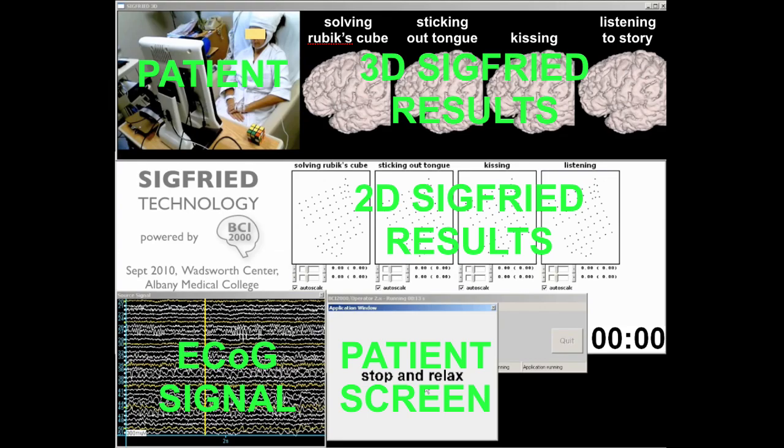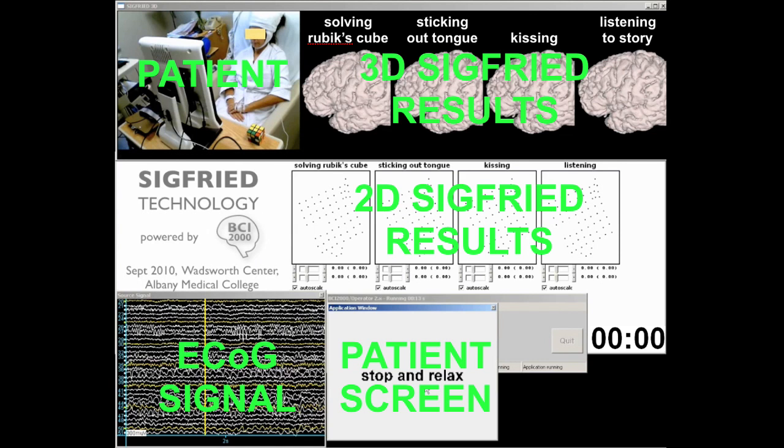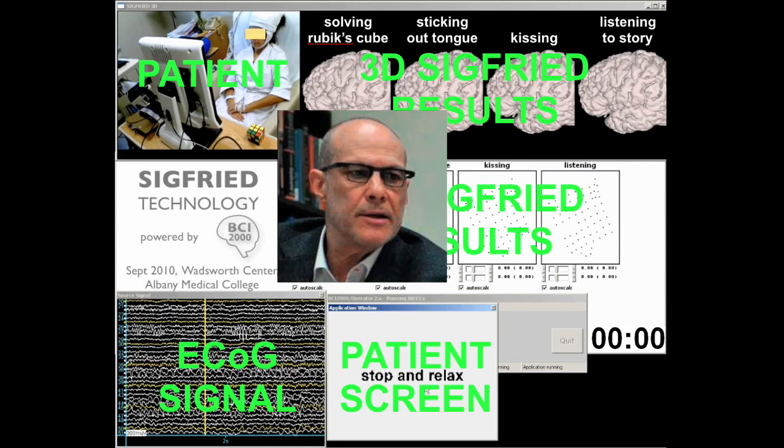Now, all of that was post-processed data. To be clinically useful, we'd want a system that makes use of this information in real time. And this is technology, again, developed at the Albany Medical Center and the National Center for Adaptive Neurotechnologies in Albany, New York, by a very talented pair of scientists and engineers, Peter Brunner and Gerwin Schalk, who's my PhD advisor, and talented neurologist Tony Ritaccio. He's now at the Mayo Clinic in Jacksonville.